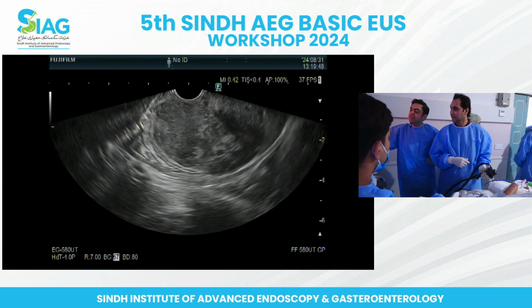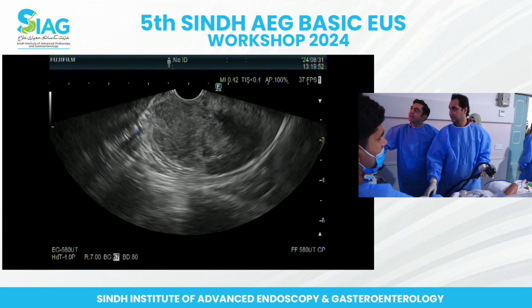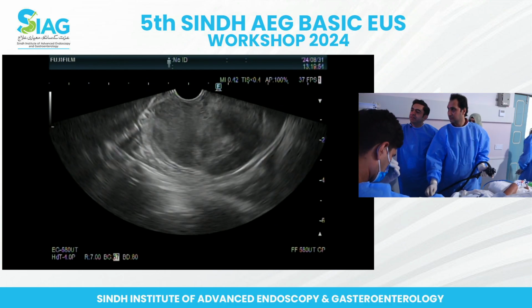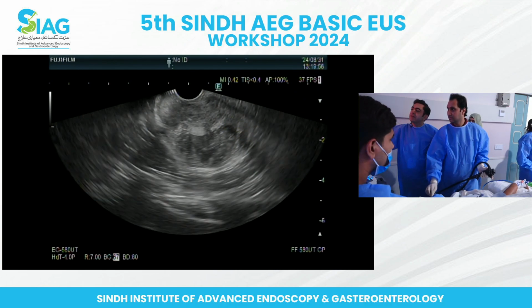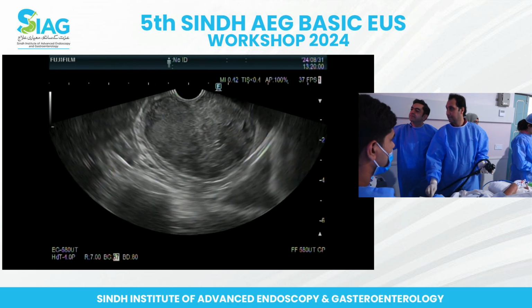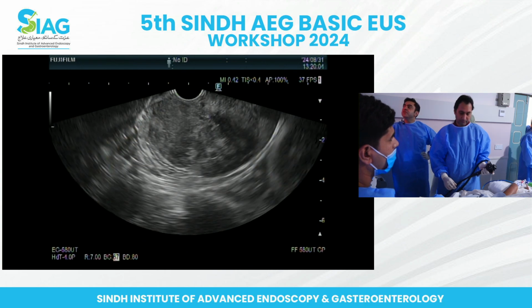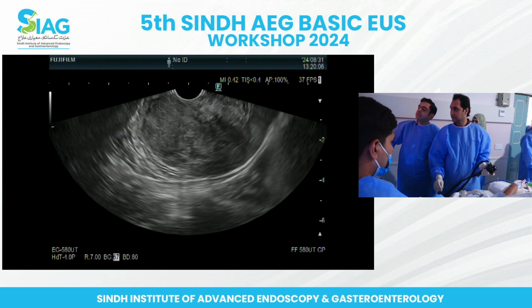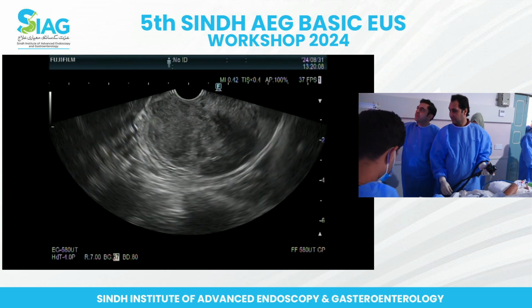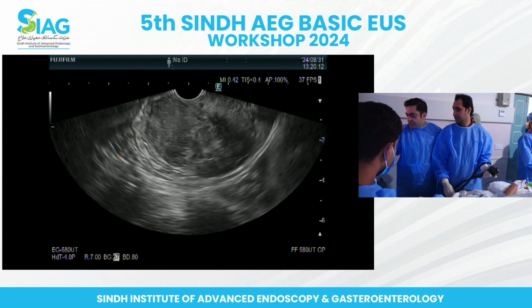So it's a very large lesion and we can wash that. Can we bring that back until we start the next one? Yeah. उसका हाँ जी बायोप्सी वाला करवा दो. Needle आगे जो दोबारा. So we were just trying to describe the lesion, we measured it, it looked fairly large, roughly 5 centimeters or so, we'll try to measure it again.